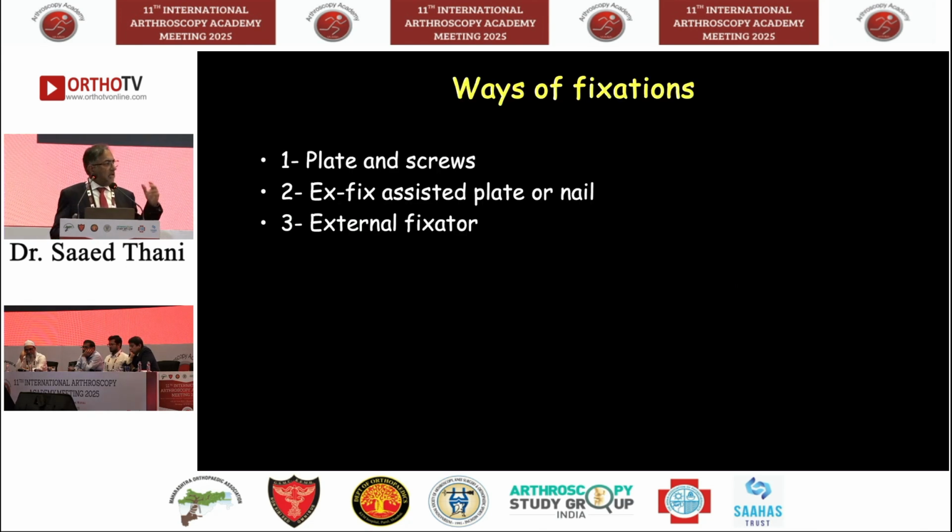There are different types of fixation. You can use an Ilizarov technique, or you can use a nail with a plate. There are many ways of doing the osteotomy. It depends on the deformity you are correcting and what is good in your hand. If you are an Ilizarov surgeon, everything looks like an Ilizarov fixation. So we talked to the patient. The patient was not keen on having any external fixation, so we planned to do it with the medial plate in one go, acute correction.